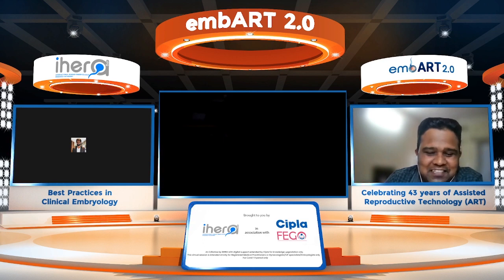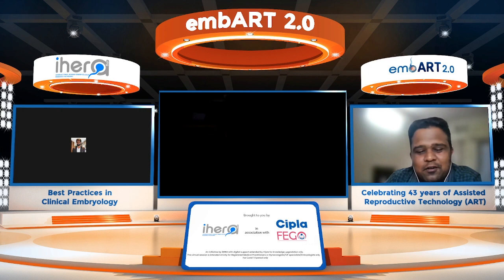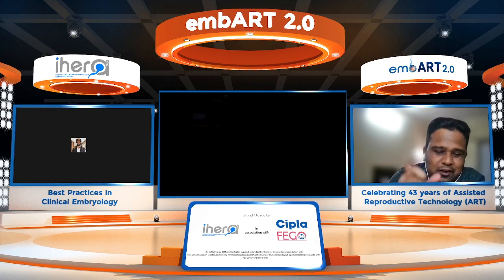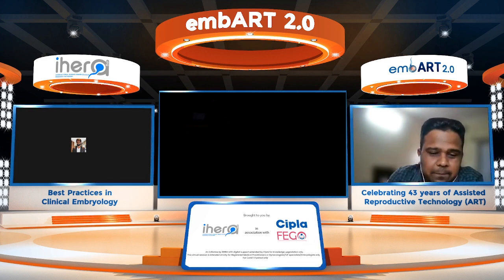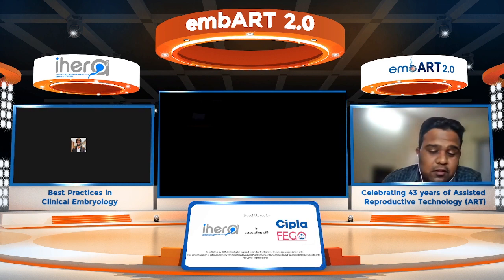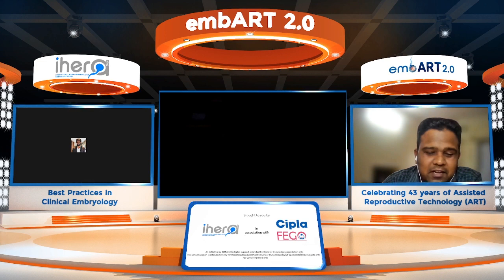If you are using a centrifuge which has a 37-degree temperature and costs you around 2-3 lakhs, at that time you can spend that amount, but you are not able to. See, temperature-regulated centrifuges are not generalized, right? There are only a few centers using it. People are not going for it. Basically, they are dependent on the normal centrifuges, right? But you can spare a time of 1.5 hours for a routine sperm preparation.